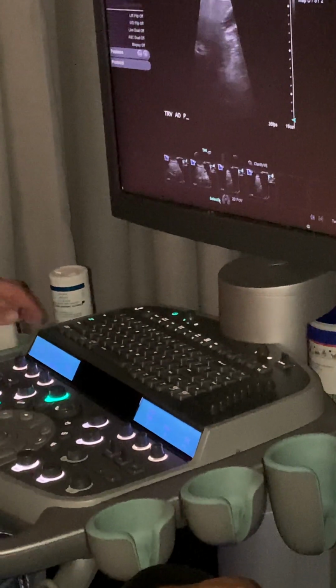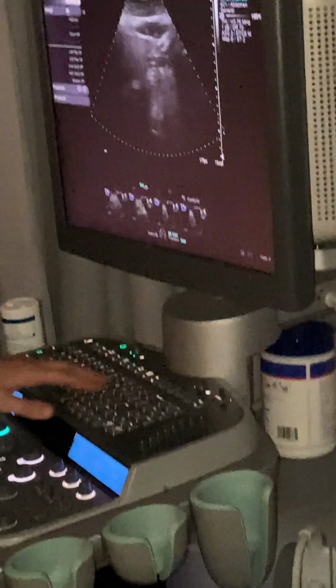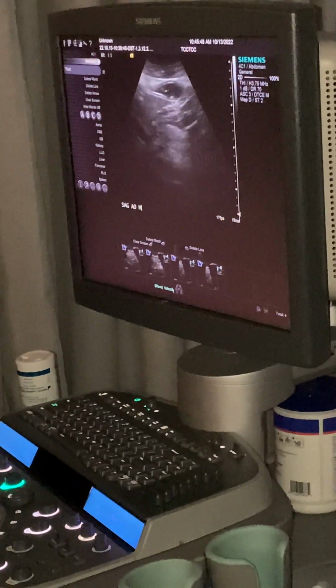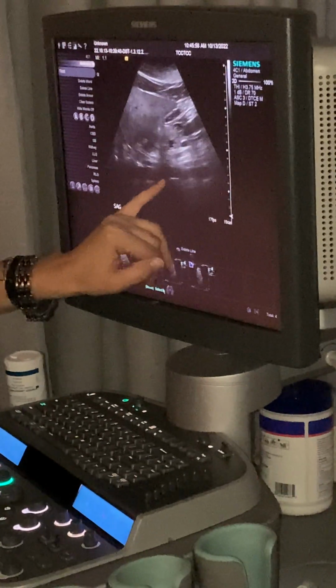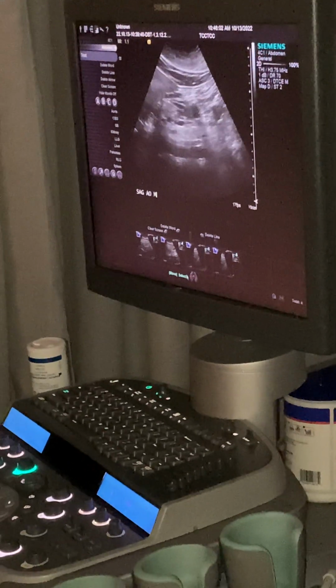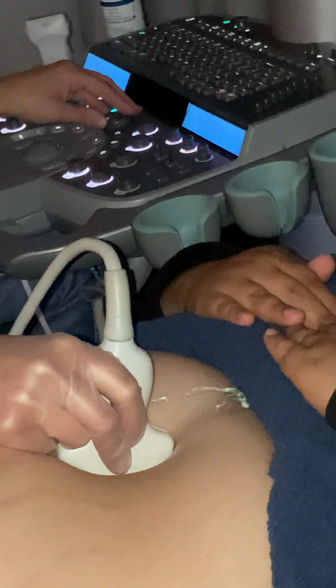Okay, who's up next? Sag mid. You got it. Are you seeing a pattern here? If we do Sag, and then we do transverse. Okay. So Sag AO mid. Go ahead and big breath in. So here we were, where we were at our prox, and then this is kind of pancreas. We're not seeing clear SMA, so we should go just kind of past the liver a little bit. Now this area loves to get a big bowel cloud. Can you guys kind of see it's kind of cloudy? So we're just going to give her a little bit of a push and sit on it for a second to try to elongate it out as much as we can.